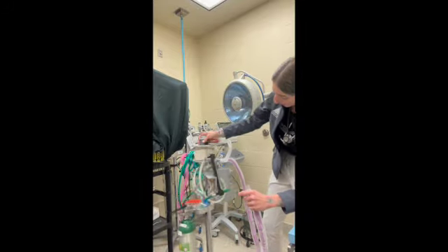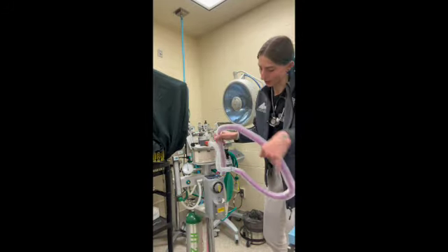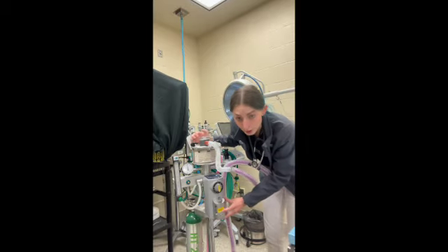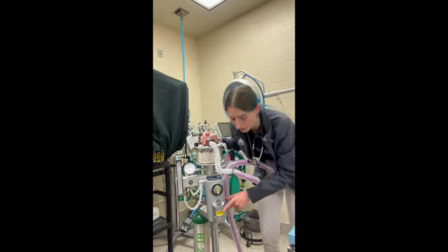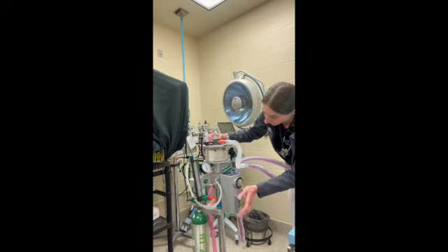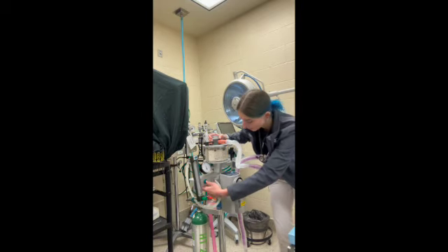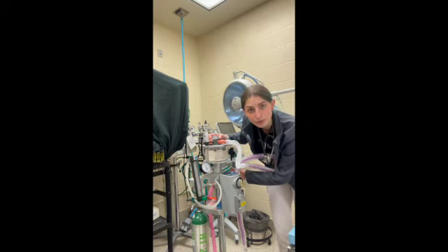Following around here, on the front, this is where you will instill your inhalant, and here is your knob to set your inhalant to different percentages. Here is your oxygen flush valve that you can utilize to flush your reservoir bag.